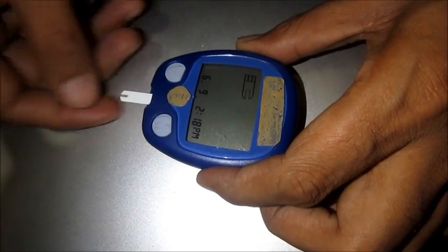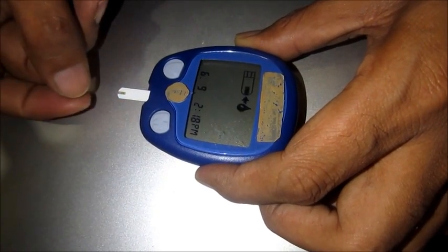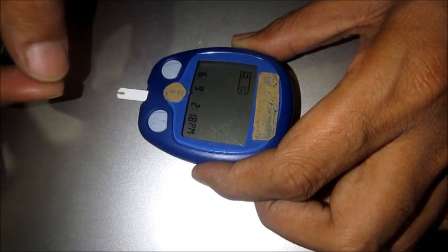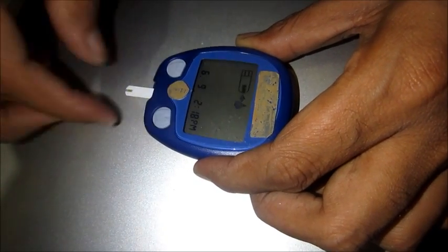This current is measured, which is directly proportional to the glucose level, and then you get the values displayed on the screen.